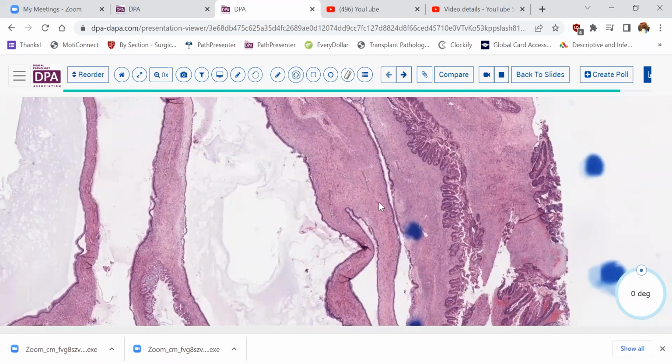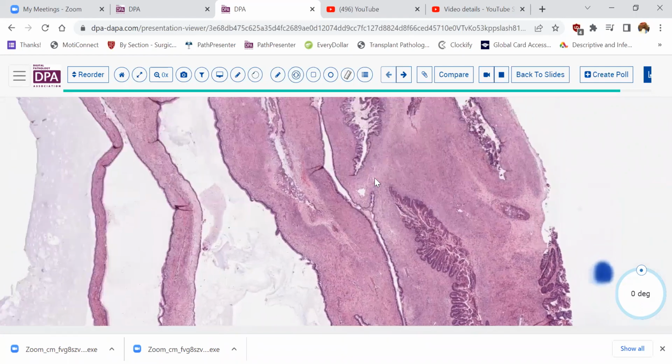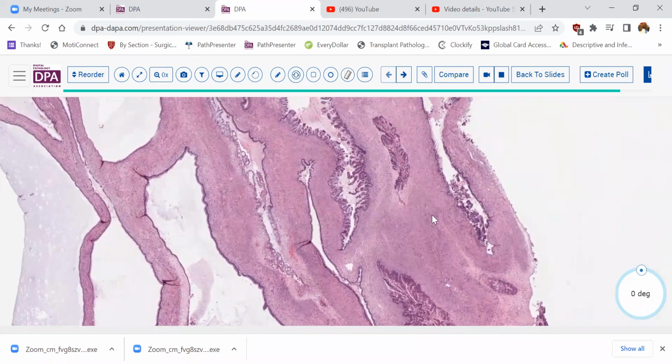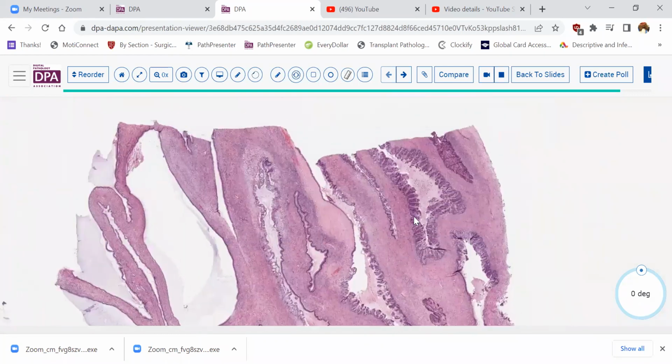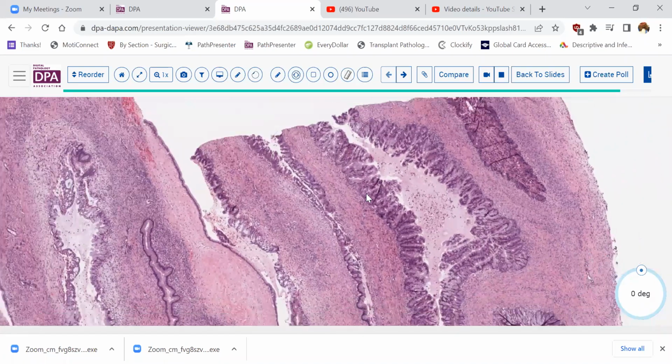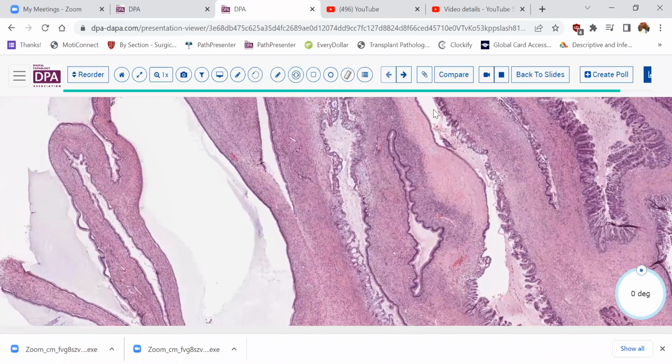The saving grace in this circumstance is that tumors with very localized areas of stromal invasion, so-called minimal stromal invasion, have an excellent prognosis and are not decidedly different from borderline tumors in general. In fact, tumors with intraepithelial carcinoma have not been stratified to identify any additional statistically identifiable risk of adverse outcomes. So although we make those distinctions because morphologically these are clearly different looking types of tumors, in terms of outcome, we have as yet been unable to clearly identify any difference, which is very reassuring to us and of course to the patients.